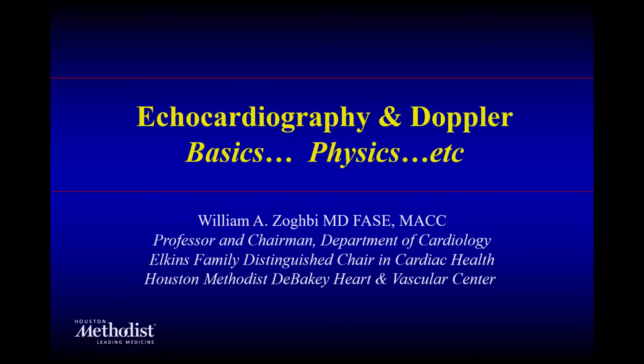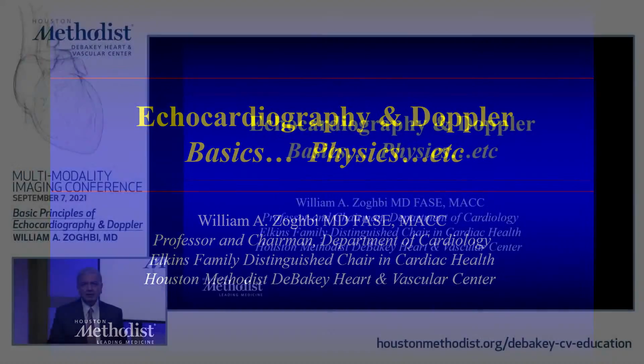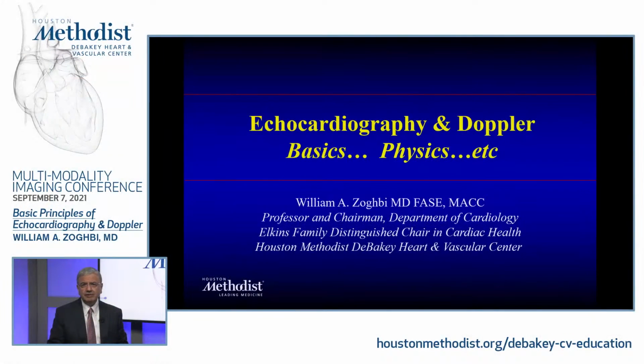It's a great primer for us to start looking at what goes behind the scene in imaging. And later on during the year, we will address its applications, advantages, disadvantages, and the nuances that you really need to have as you engage in cardiovascular imaging, be it any trainee or even specializing in cardiovascular imaging.